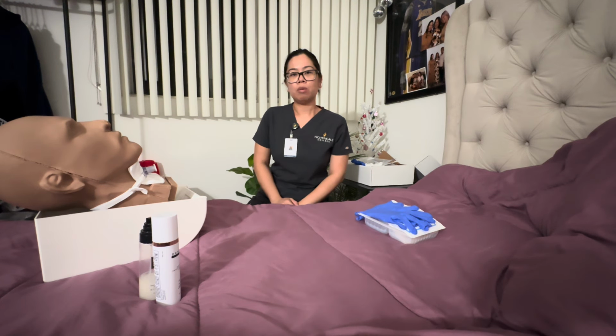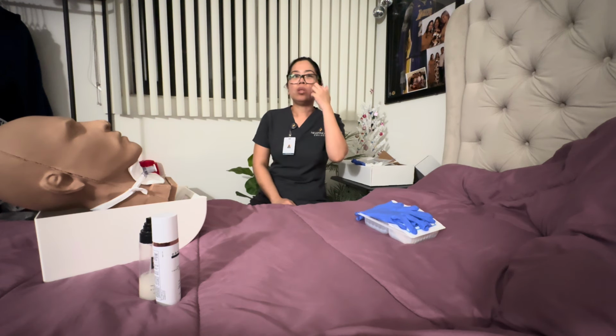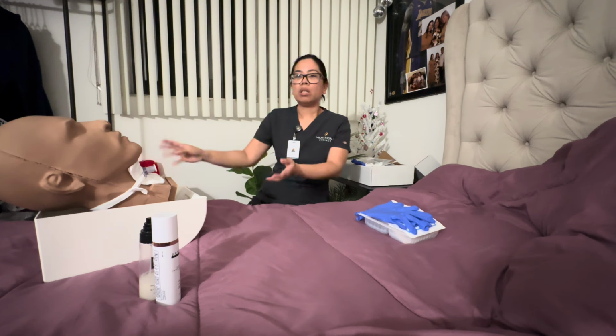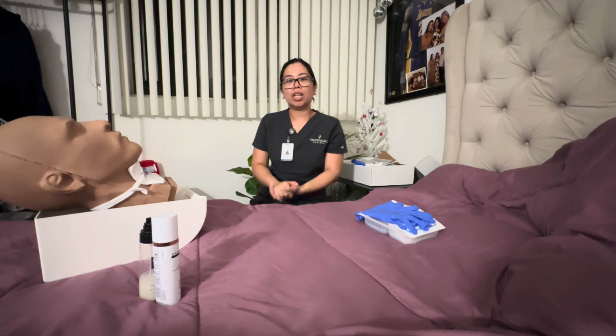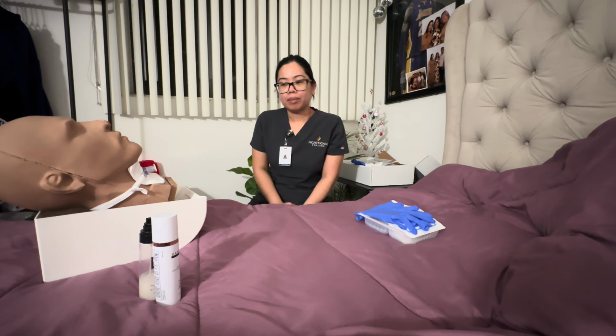Okay, so for tracheostomy care, we will need a provider's order, and we need to make sure we have the right patient, that we verify with two patient identifiers, and that we understand why the patient is getting tracheostomy care. When we go to the patient's room, we want to provide privacy, introduce ourselves, and do hand hygiene, and like I said, the two patient identifiers for this patient.